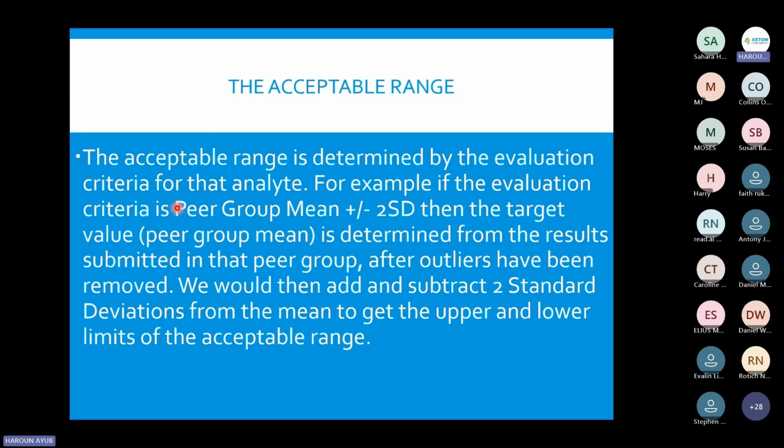Sometimes you might ask about QCs, where it's very direct how you usually calculate your standard deviations. You have an IQC, you have a mean, and you are given the upper range and the lower range. So how do you calculate the standard deviation? If you are using 3 SDs, you take the upper limit minus the lower limit divided by 6. When you divide by 6, it means 1 SD is the difference between the mean of 0 and plus 1 or minus 1.